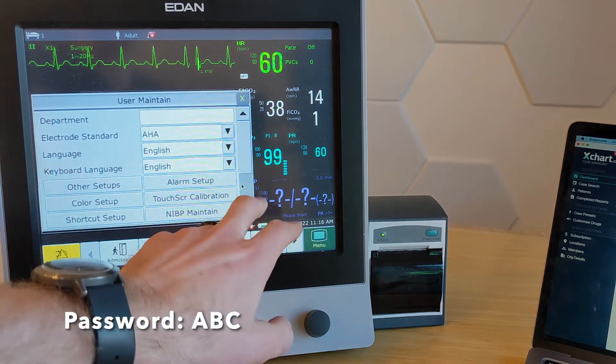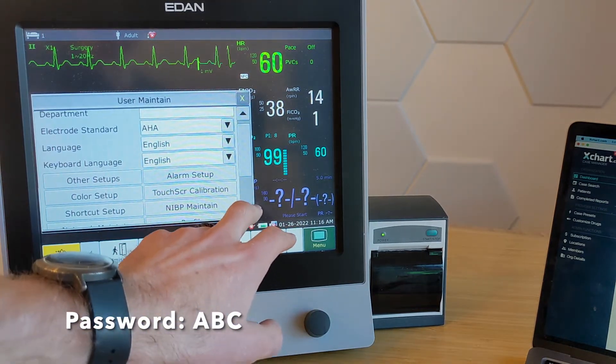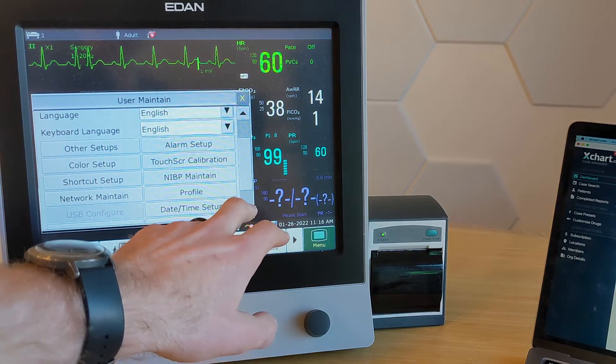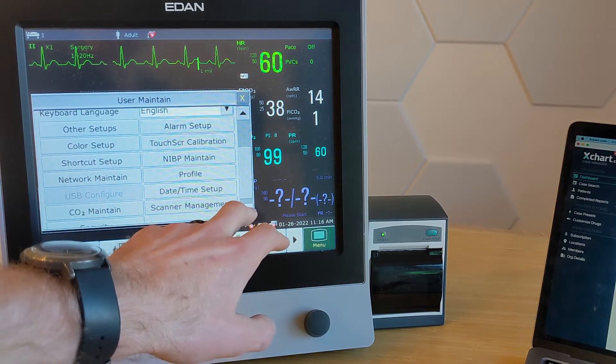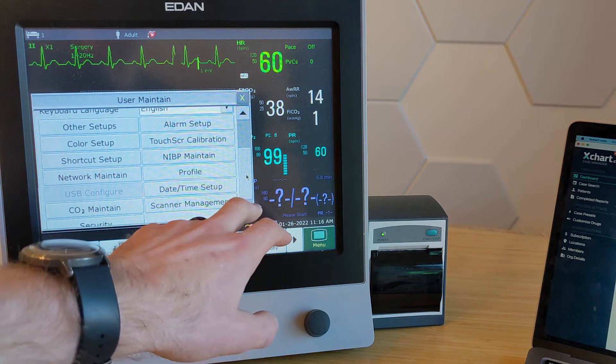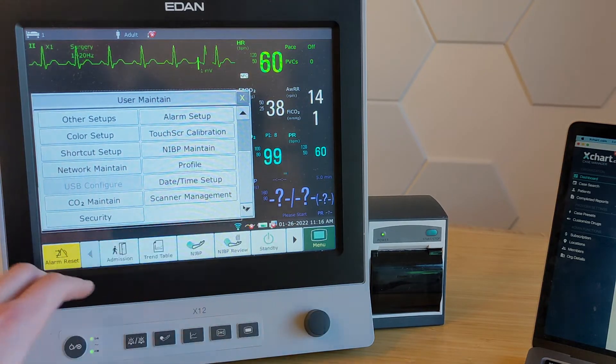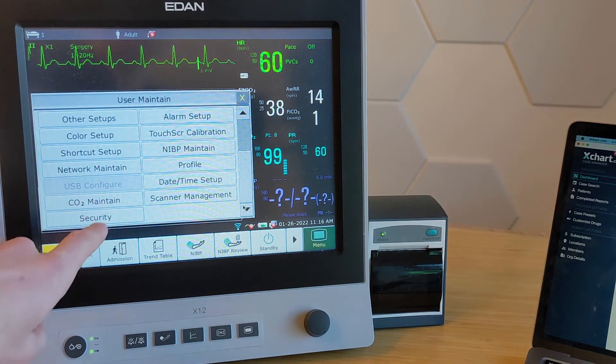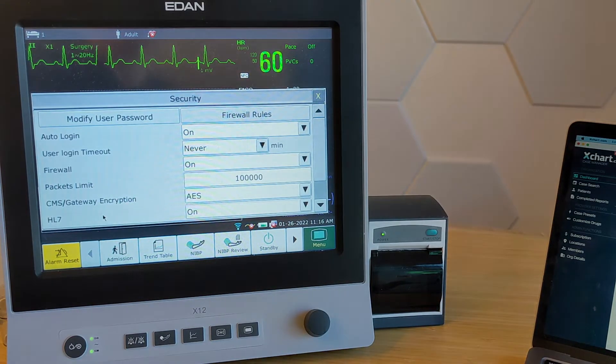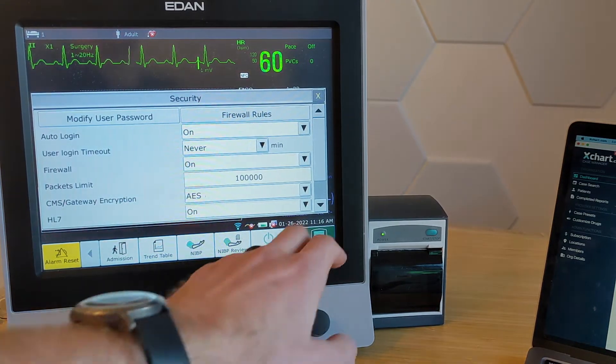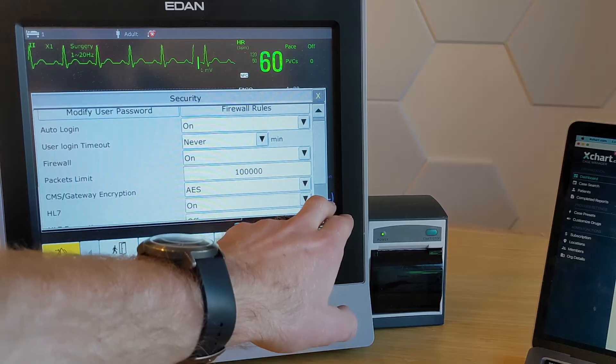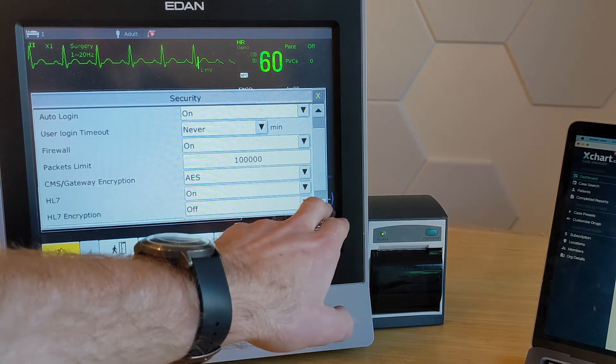And then we're going to scroll down to the bottom here, and there is a few key things. So first of all, for security. On the security page, you can turn on what interfaces are available to this device.